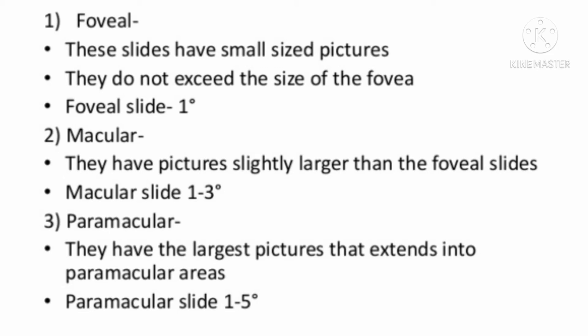Similarly, macular. Macular slides have pictures slightly larger than the foveal slide, with one to three degree angle at the nodal point of eye. Then comes the paramacular. These slides have the largest picture that extends into paramacular areas, with one to five degree angle at the nodal point of eye.